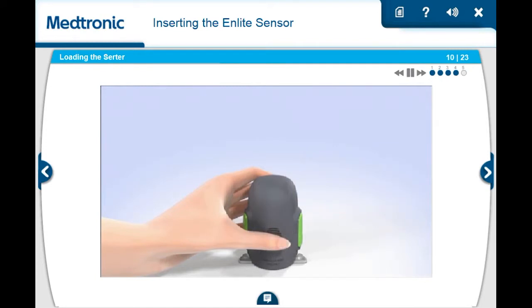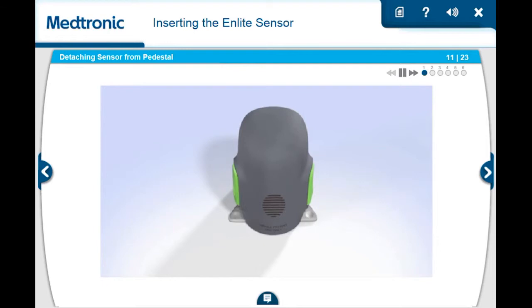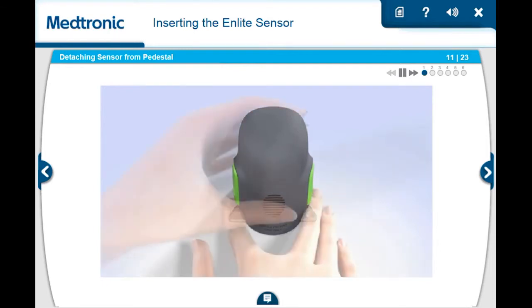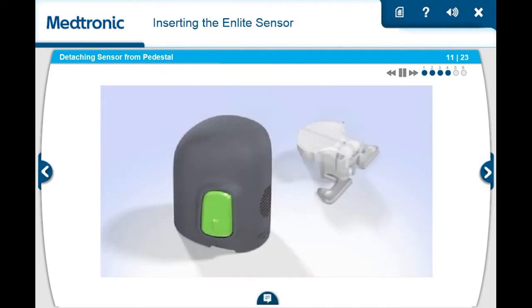Do not push the serter too hard onto the sensor, as this might cause the sensor to load improperly. To detach the serter from the pedestal, be sure your thumb is still placed on the thumbprint and you are not touching the buttons. Place two fingers on the pedestal arms, holding it in place, and slowly pull the serter straight up. Do not detach the pedestal in mid-air, as doing so might damage the sensor. After the pedestal is detached, the sensor remains inside the serter. This step also removes the adhesive liner from the sensor.